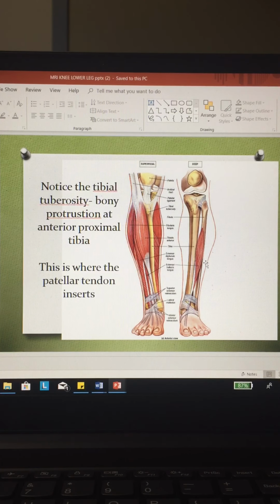So think about, when you're doing your practical, and if Kelsey or whoever your patient is, where is the pain in your lower leg? Where is the lump? Sometimes patients will come to me and say, I feel something right here, and you can almost feel like it's a knot. We can put an oil marker over that area, and we make sure that we get as much of that lower leg as possible, and wherever it's closest to one particular joint, I get that joint included, okay? But you don't want that oil marker in the center per se, because I really want to get as much of that muscle and tendon as I can. Okay, does that all make sense?